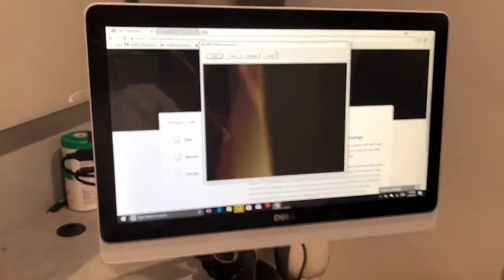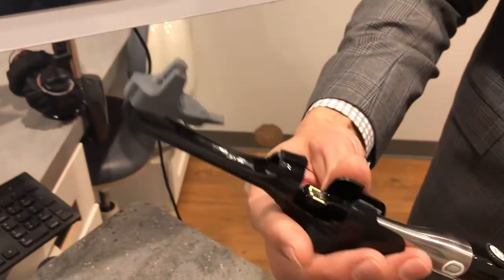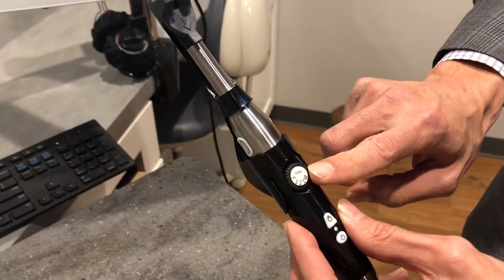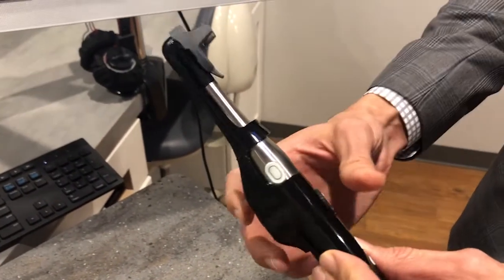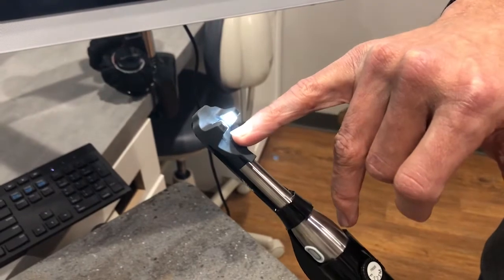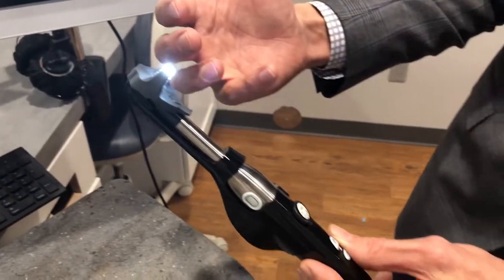When we have our image screen up, we're going to take the Loom device and simply attach it to the top of the existing Iris 2.0. You want to turn your light off on the camera, make sure the camera is set at the one setting, and then simply touch the button on the back to turn on your light.